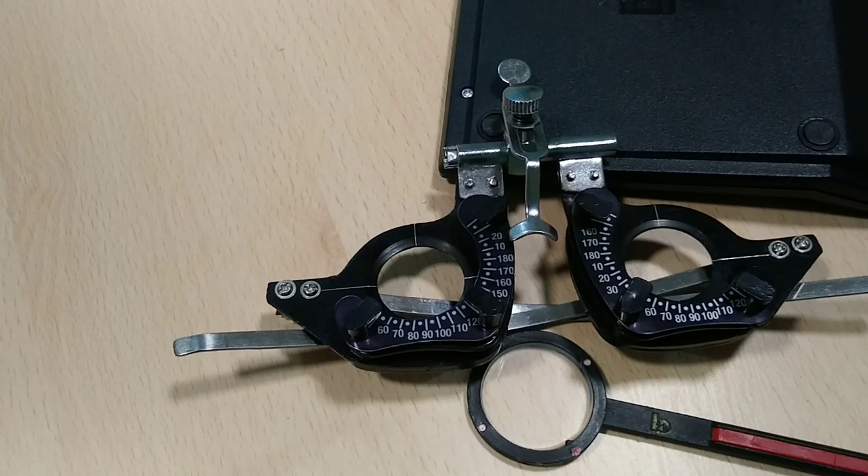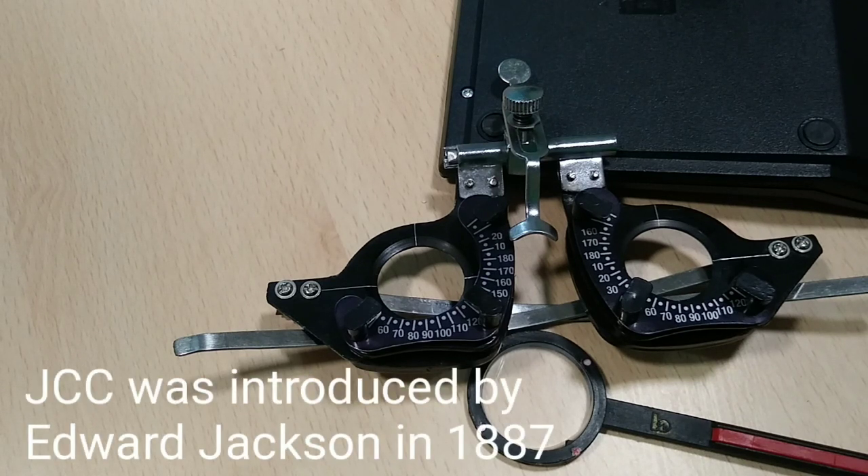JCC, also known as Jackson Cross Cylinder, was introduced by Edward Jackson in 1887.